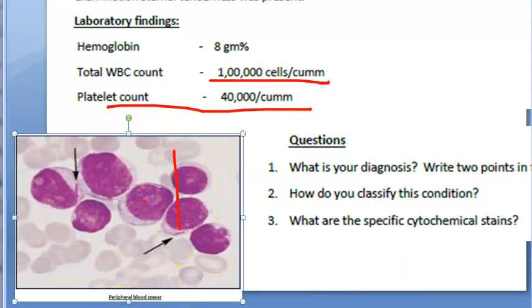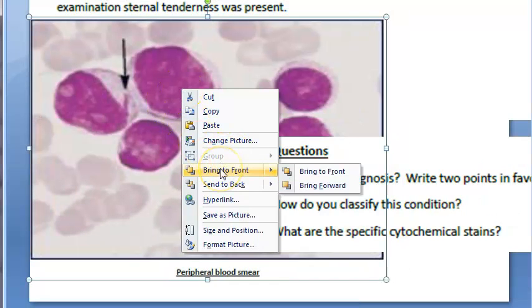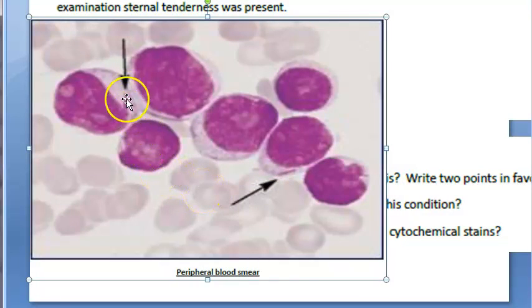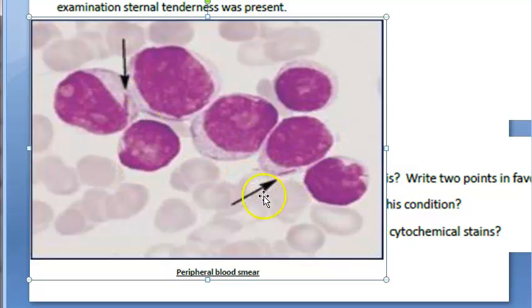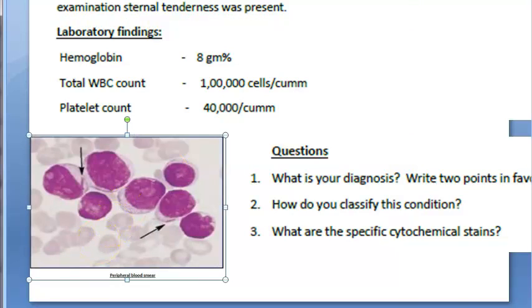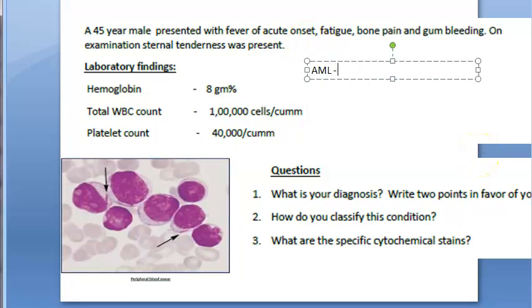In the peripheral blood smear, you can see some bodies in the cytoplasm — these are Auer rods. When you see Auer rods in such a clear picture, the diagnosis is AML, that is Acute Myeloid Leukemia. Remember, in Chronic Myeloid Leukemia (CML) there will be no Auer rods.